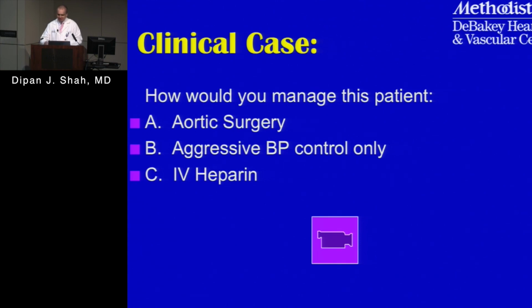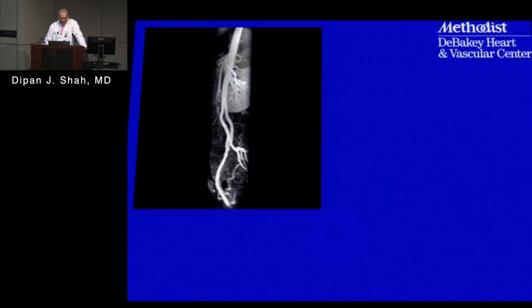Yeah, you're absolutely right. So there's, what's that? There's no what? TE? Yeah, TE never suffers from artifact issues, so that's great.